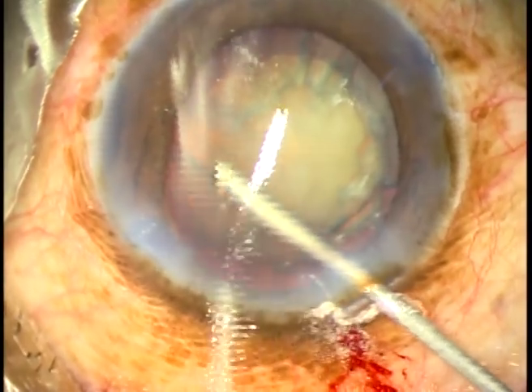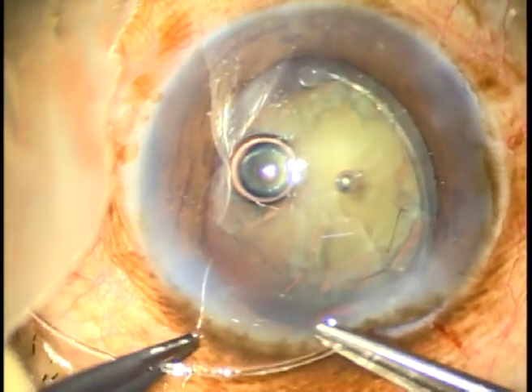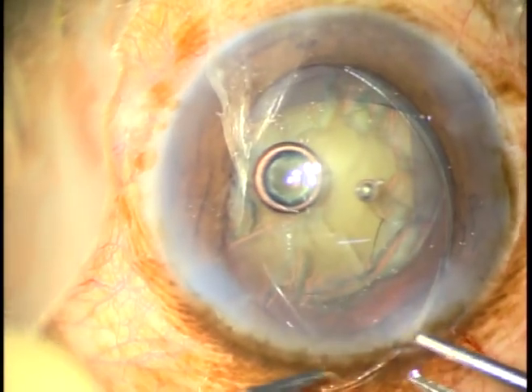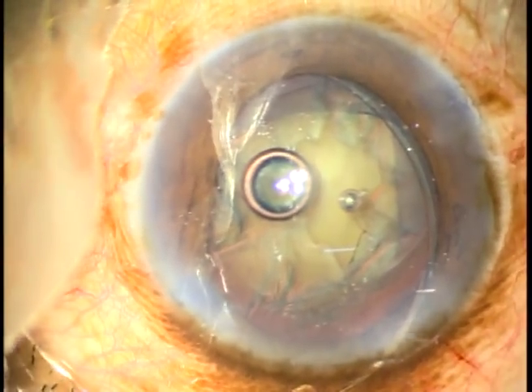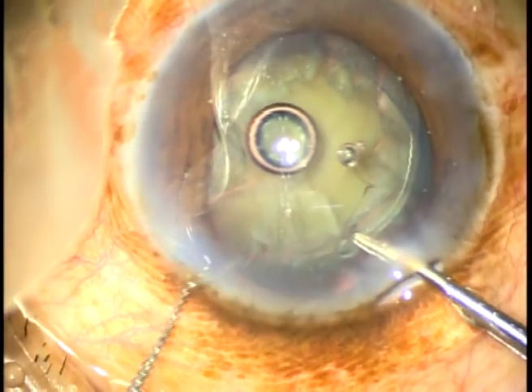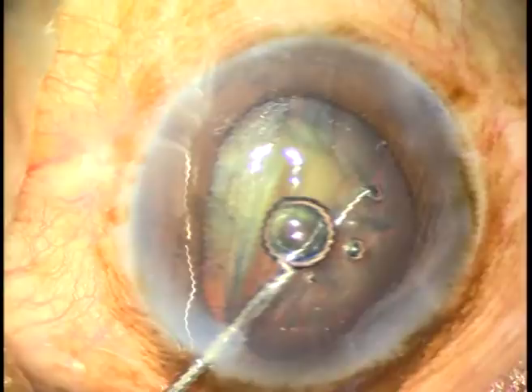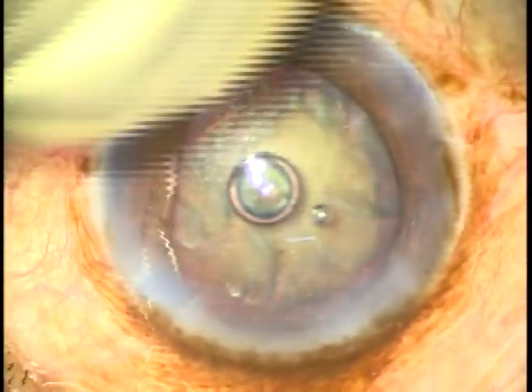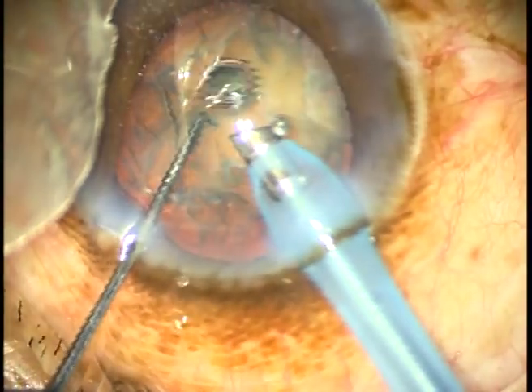I make the anterior chamber free of vitreous strands. Now, after injecting viscoelastic substance, I put the CTR. The leading end goes under the rhexis, under the anterior capsular rim. I hold the trailing end, introduce a Sinskey hook and try to place it. But I cannot release it. When this happens, take a chopper or another Sinskey hook in your right hand, go there and just press — the Sinskey hook has no other way but to release the trailing end of the CTR.